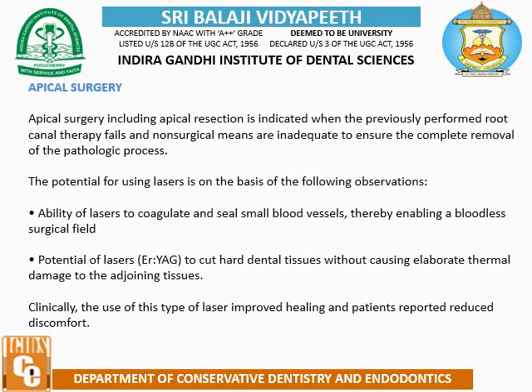Apical surgery. Apical surgery, including apical resection, is indicated when the previously performed root canal fails and non-surgical means are inadequate to ensure the complete removal of the pathogenic process.